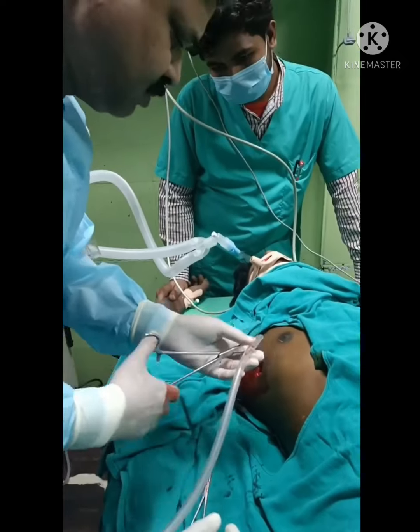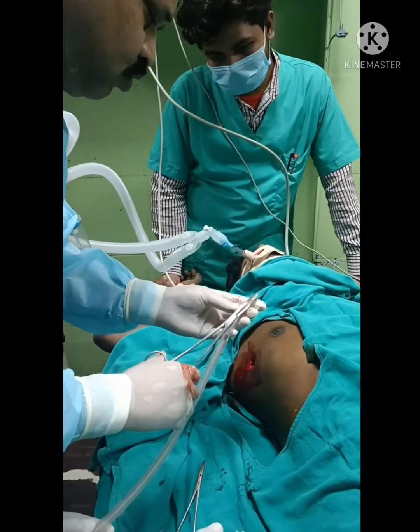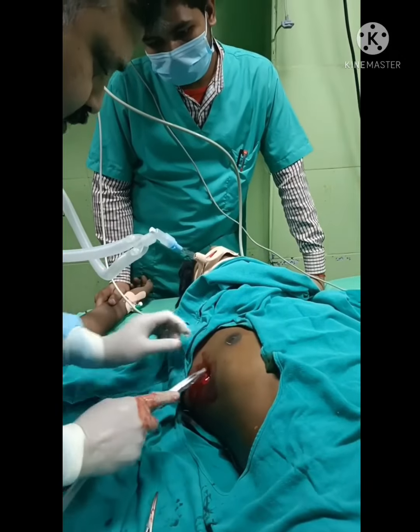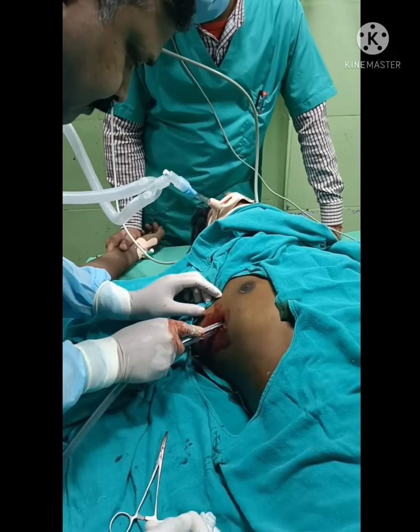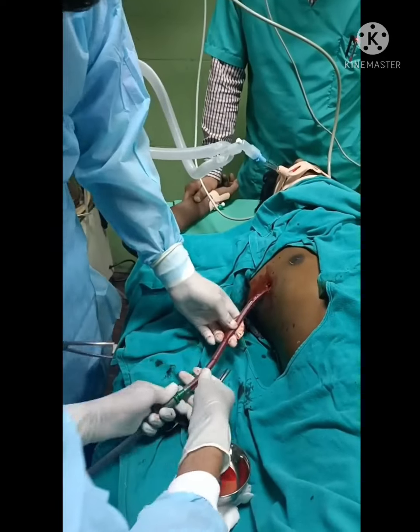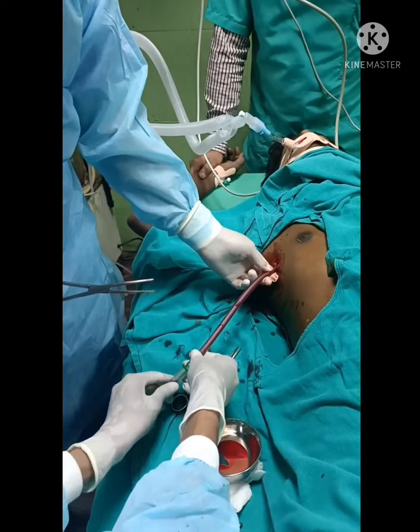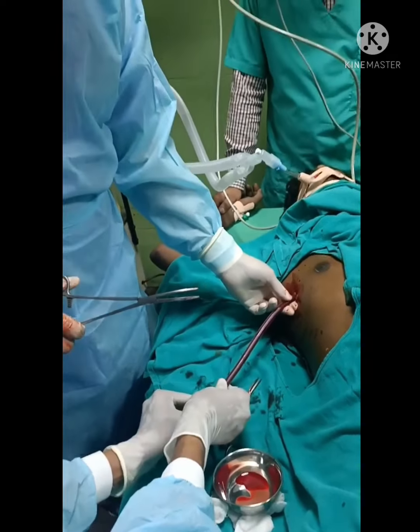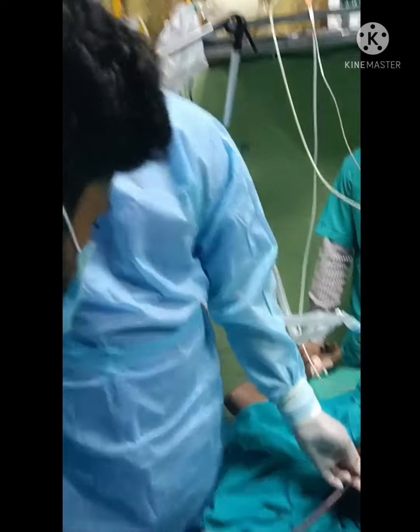And then mount the tube on the large clamp. And then the tip should act as a guide. Insert. So once you insert this much, you should insert the tube till the last eye and 2 to 3 centimeters more, and just see the column.